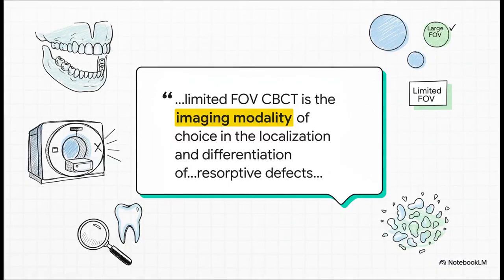And that's exactly why the leading authorities, we're talking the American Association of Endodontists and the American Academy of Oral and Maxillofacial Radiology, put out this joint statement. And it's crystal clear. For these resorption cases, a limited field of view CBCT isn't just a good idea. It is the imaging modality of choice. This is the standard of care now, because we've learned the hard way that trying to guess with 2D images leads to misdiagnoses and failed treatments.